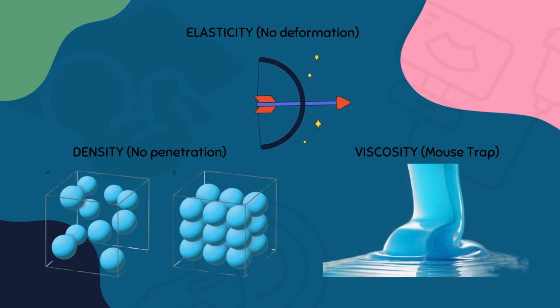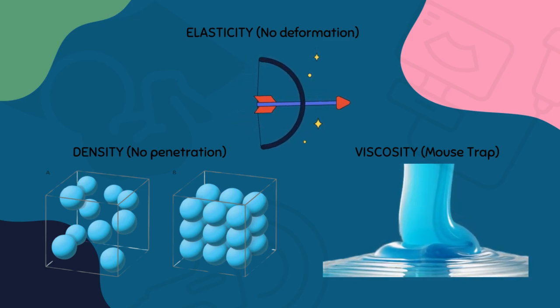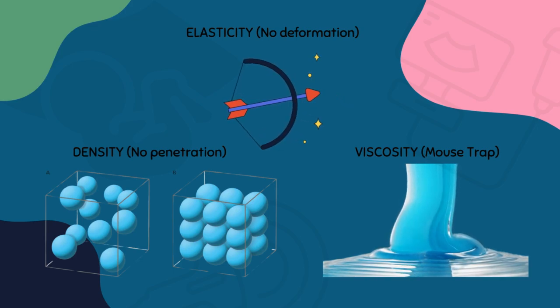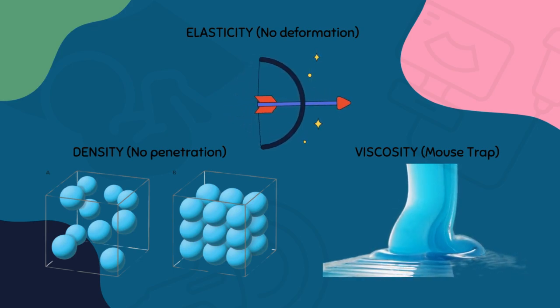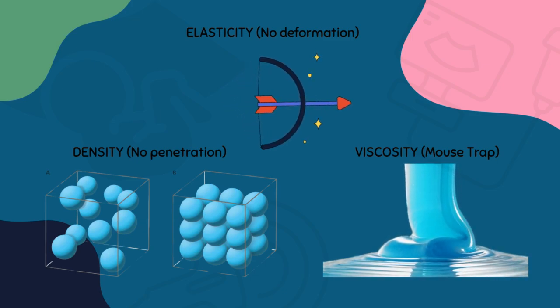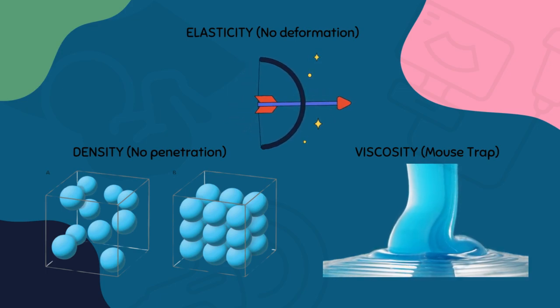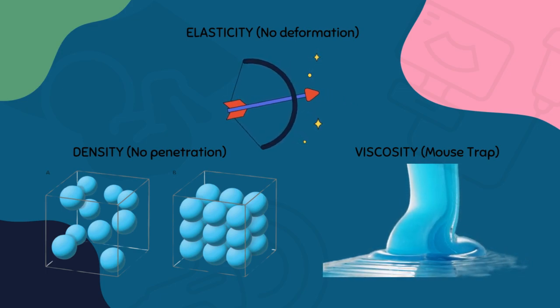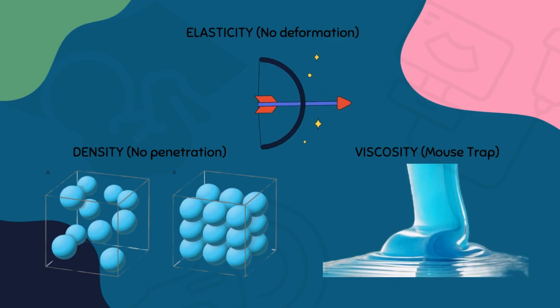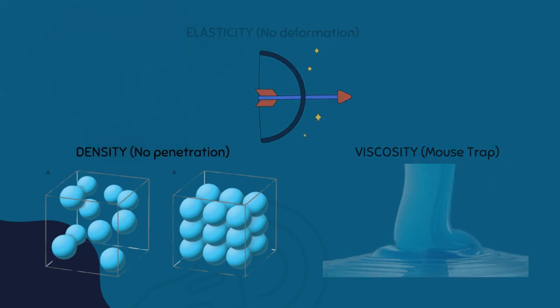In the same way, a very viscous material will trap or absorb sound waves, converting them into heat energy, not allowing for their transmission through the object and not allowing for their reflection back from the object surface or the object layer which it bounced off.